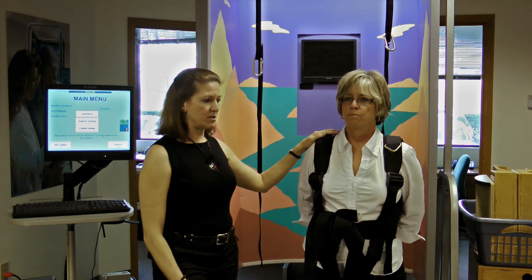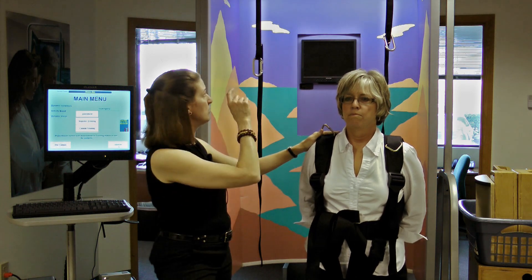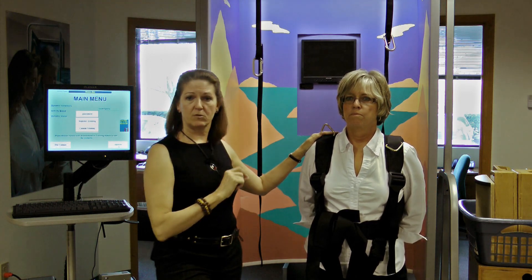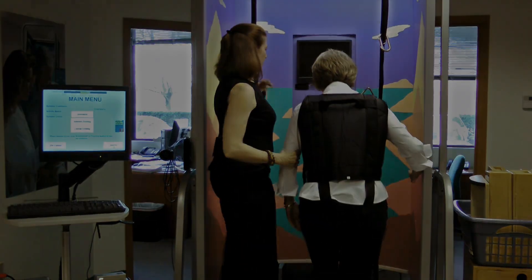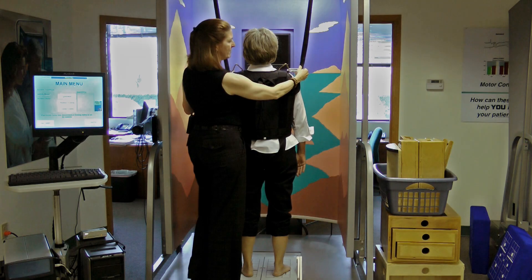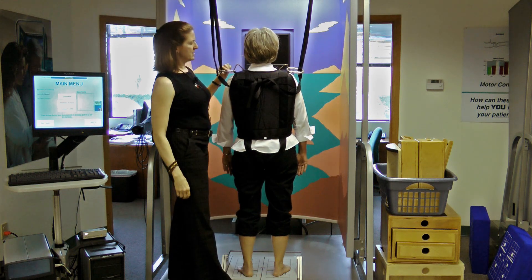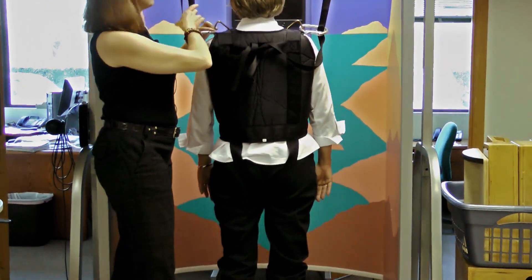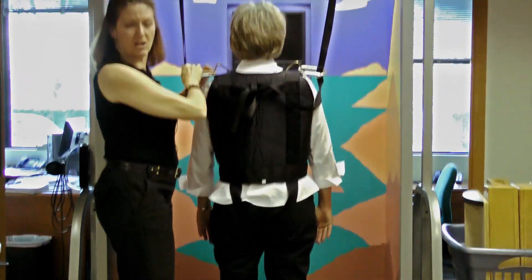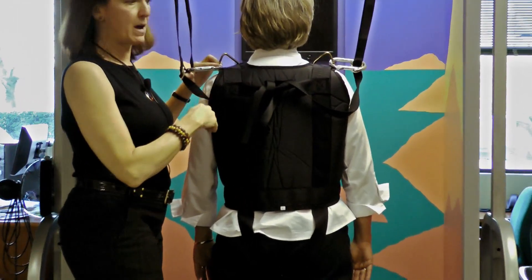We put a harness on Mary here, and she's going to be strapped into the system to prevent falls. Once we have her strapped in, we like to see that the carabiner — this metal ring — is sitting about at the level of her shoulder. So the strap is taut, but not so tight that it's going to catch her when she is just swaying back and forth.